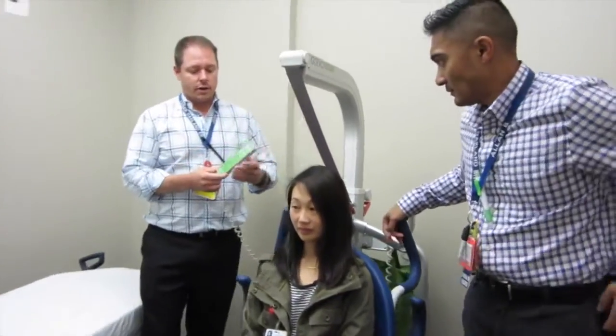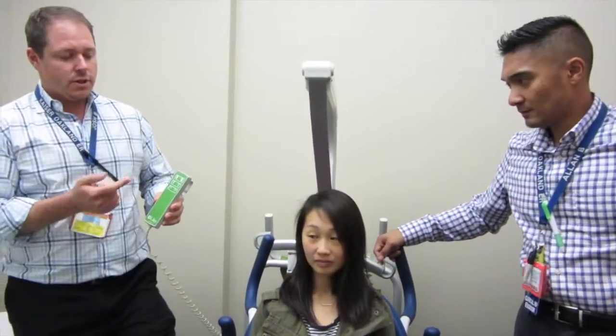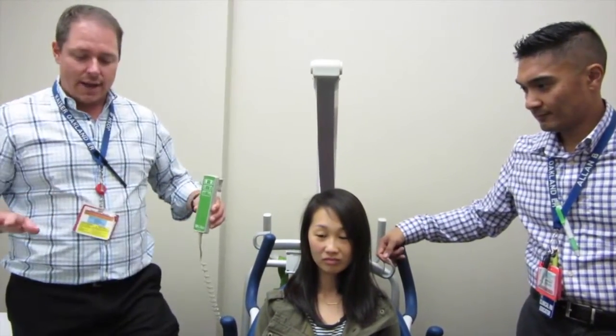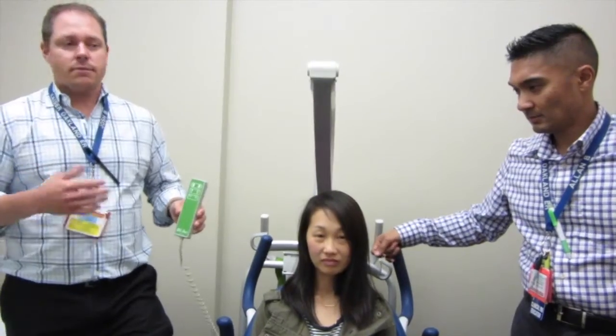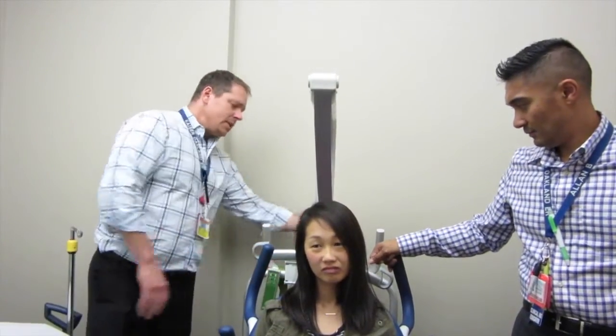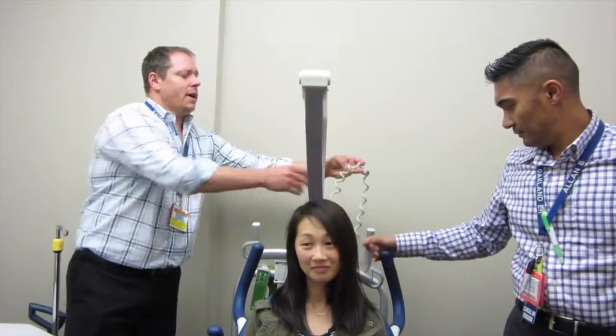In terms of the actual Golvo itself, there's just a couple things to know about it. You've got your control arm, or remote control essentially, so you can go up and down fast, up and down slow, and then you can widen your base of support down here. It's always recommended to keep the legs as wide as you can fit them, because it'll just give you a broader base of stability.